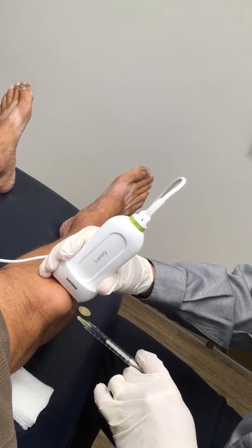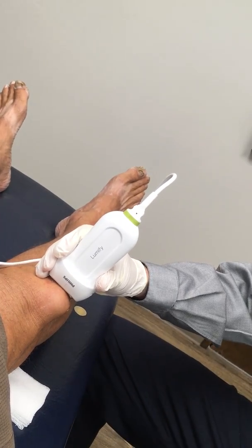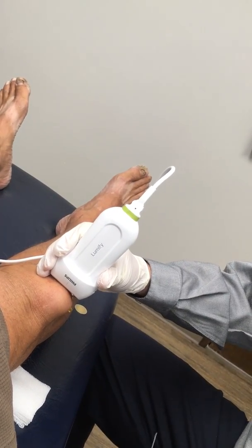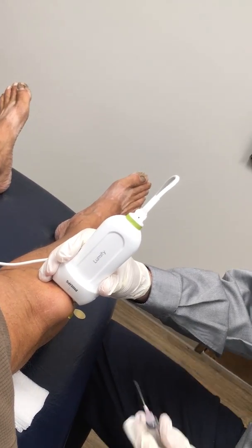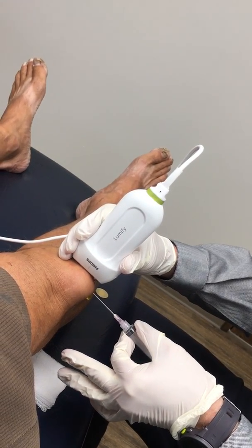So, and Larissa, can you just tap on the screen for just a second too? So there's the local anesthetic. So do a needle back there. Got it. And then already, so we've done this before. He has this thick gelatinous material that we've aspirated. So we're going to aspirate the same thing. You can already see it coming out from that puncture site. I'm going to use a larger bore needle here.